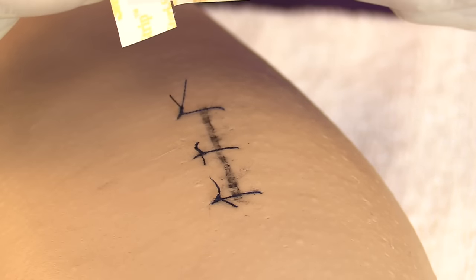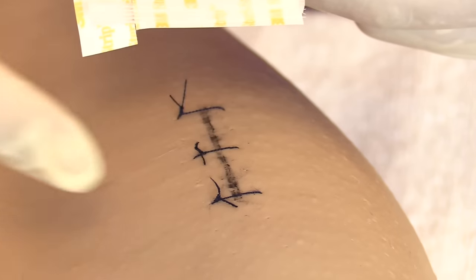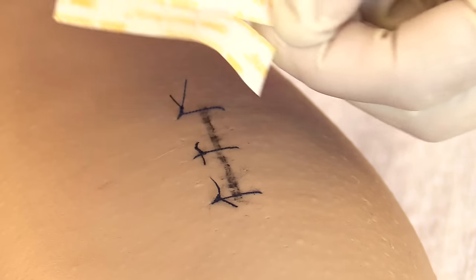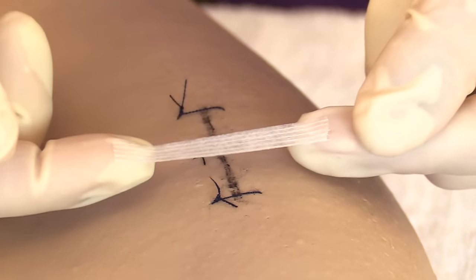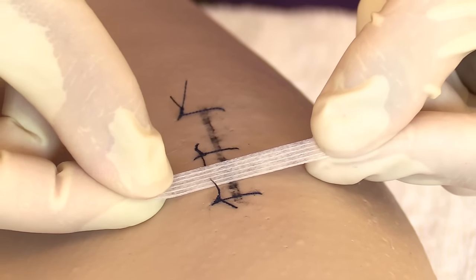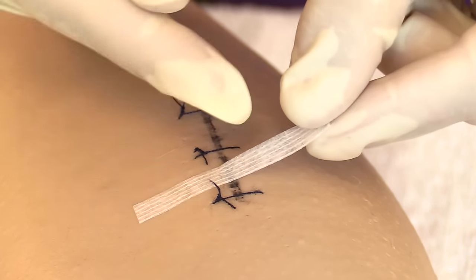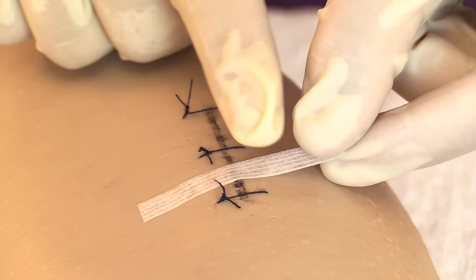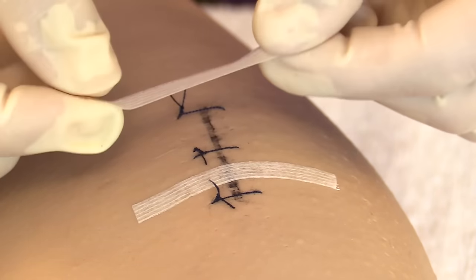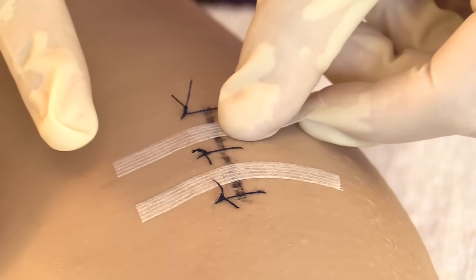Apply steri-strips where each suture was removed, cutting them so there is at least three-quarters of an inch on each side of the incision, spacing them about one-eighth inch apart. To apply a steri-strip, gently lay down one part, smooth it down, then gently lay down the other side — don't pull or tug to create tension, as steri-strips are strong and can tear the skin. Repeat for the next suture site.